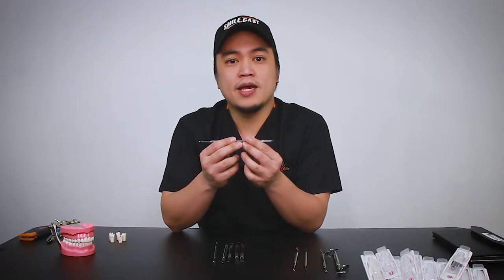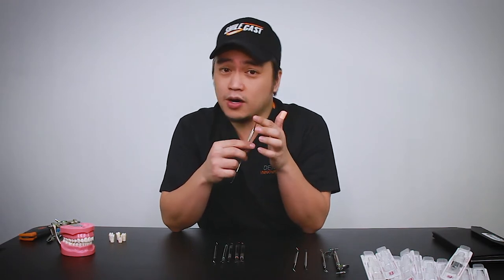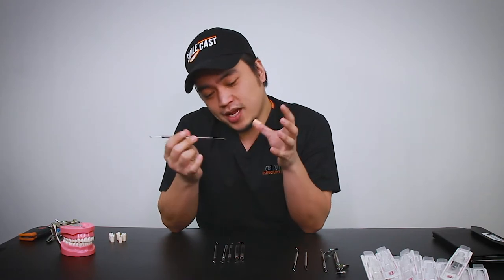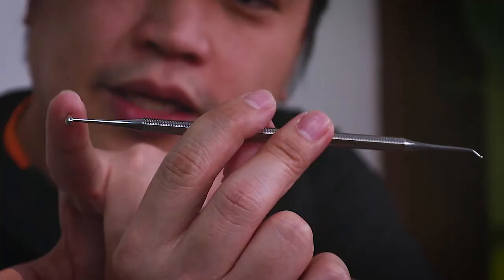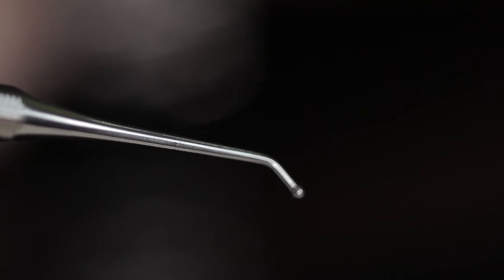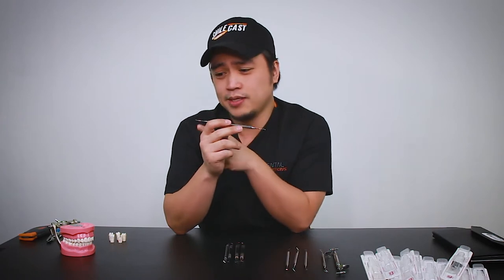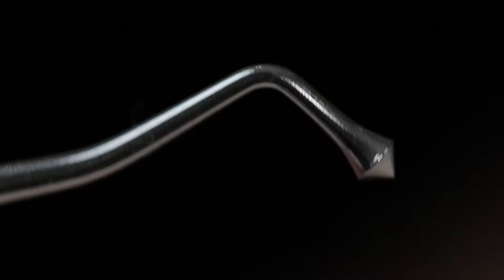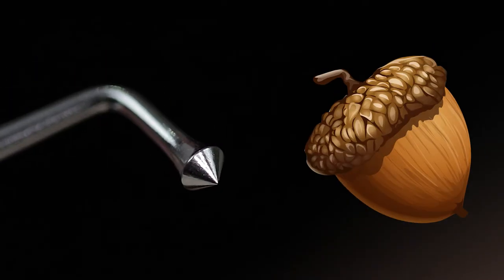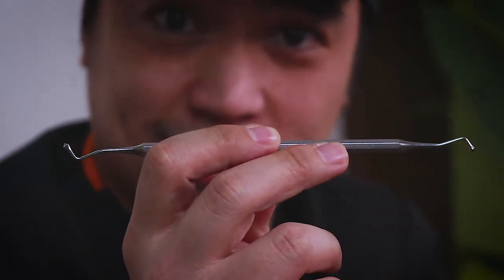Next, we have the football burnisher. The football burnisher can be used for smoothening amalgam and contouring the matrix band to that little curve so that you can get your matrix to hug better when you're using amalgam. This is actually one of my favorite ends to use for doing smaller anatomy. Here we also have the acorn burnisher, which has a triangular shaped tip on both ends — one's a little bit wider, one's a little bit narrower. If you're unfamiliar with an acorn, they sort of look like this. This helps when you're trying to carve your amalgam before getting it to its final form or shape.